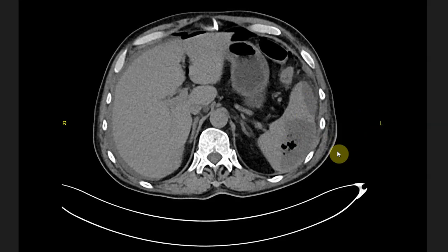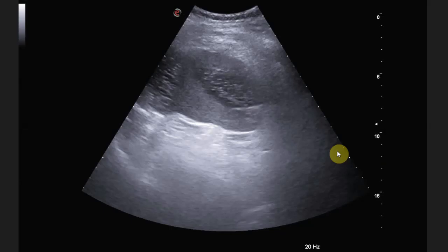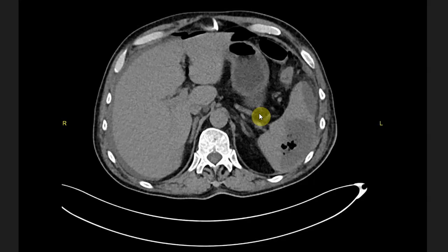These abscesses can have a variable appearance on ultrasound and on CT imaging. Especially on ultrasound, the lesion can be totally hypoechoic or can have only a few hyperechoic foci. On CT, it is mostly presented as a low density area in the spleen. In this patient, the clinical presentation and the imaging fit together, and the diagnosis is a splenic abscess.